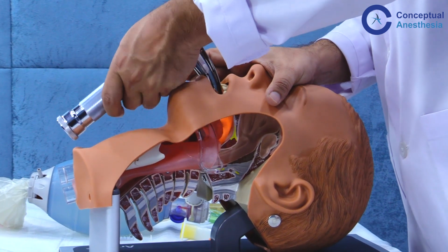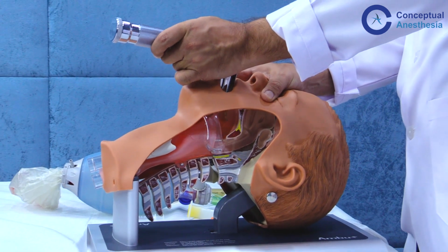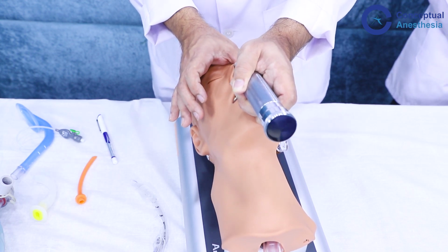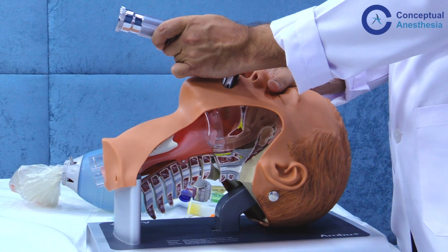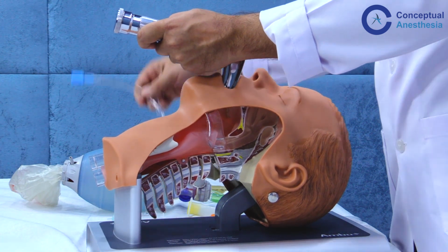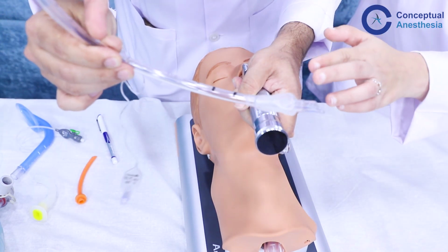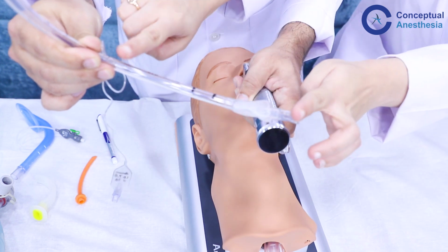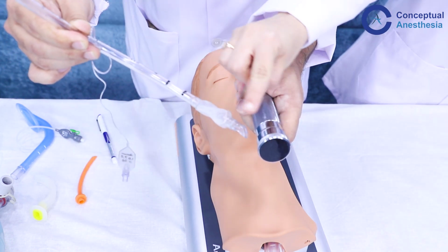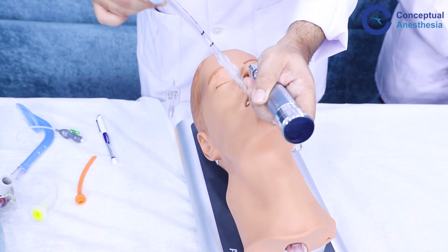Now once the tongue has been taken to one side, the next thing that I do is I give a lifting action. As you can see, the lifting is such that you don't lever onto the front teeth of the patient, otherwise it can cause the teeth to get damaged and break. Once the lifting action is done, the next thing is I will take my endotracheal tube and hold it between this part, this is 1/3 and this is 2/3, okay. So distal 2/3 and proximal 1/3. So this is the ideal position to hold the endotracheal tube so that the curve is maintained and this curve helps us to put the endotracheal tube directly into the glottic opening.